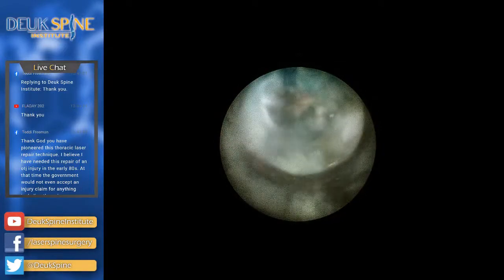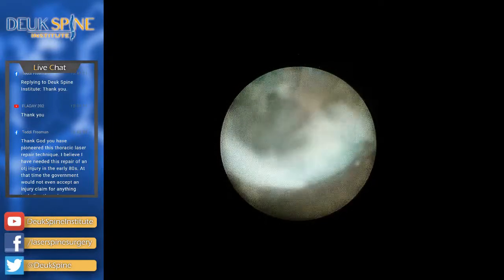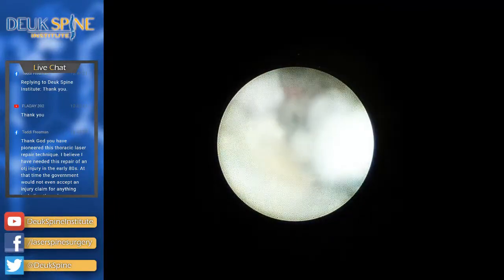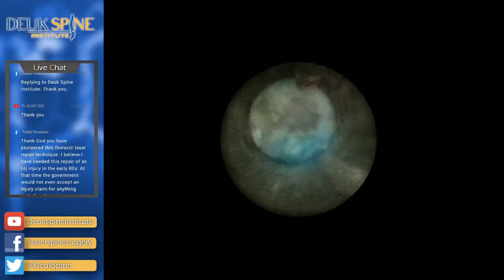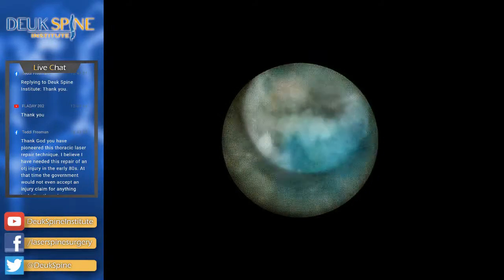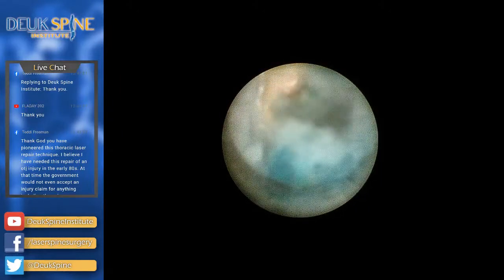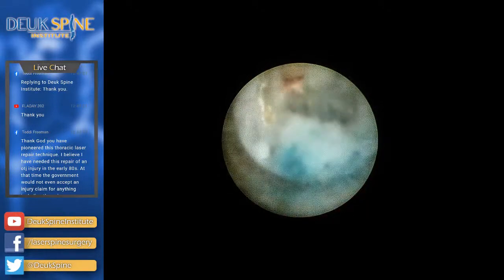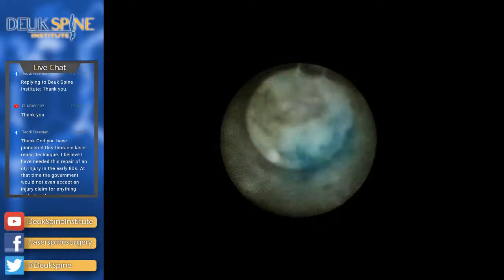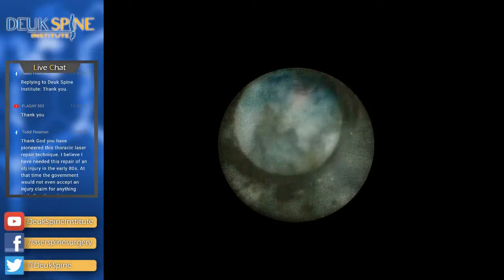But what I was getting at, for those of you following me, is that I'm not healing this disc. I'm merely setting the disc up to be healed by the patient. I'm helping the patient heal their own disc. That's what this surgery is all about. It's not a miracle surgery. It is just getting rid of the thing that is blocking the disc from healing itself. Okay? And that is the nuclear material called interposed nucleus pulposus. That's what I'm fixing. And I'm getting rid of that interposed nucleus pulposus.